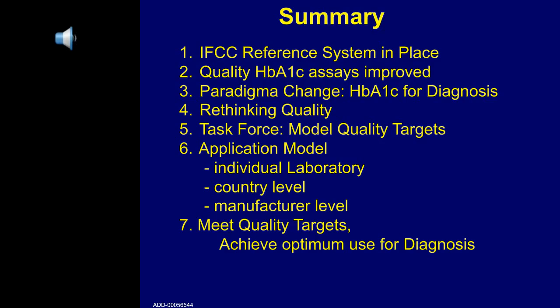The first question is, what is the advantage of a standard to a true reference material for patient care if you can convert percent to millimoles per mole? And I think probably both of our speakers will want to answer that question. Well, Kaz?